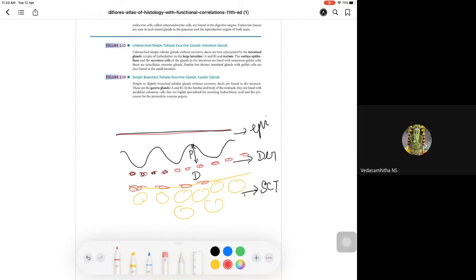And in between the dermis and the subcutaneous tissue. Now let us go to this portion and see how they are thrown into folds. These are known as rete ridges, and normally they are there. For example, if there is a skin and it is seen like this, with the adipose tissue there, it means atrophy.